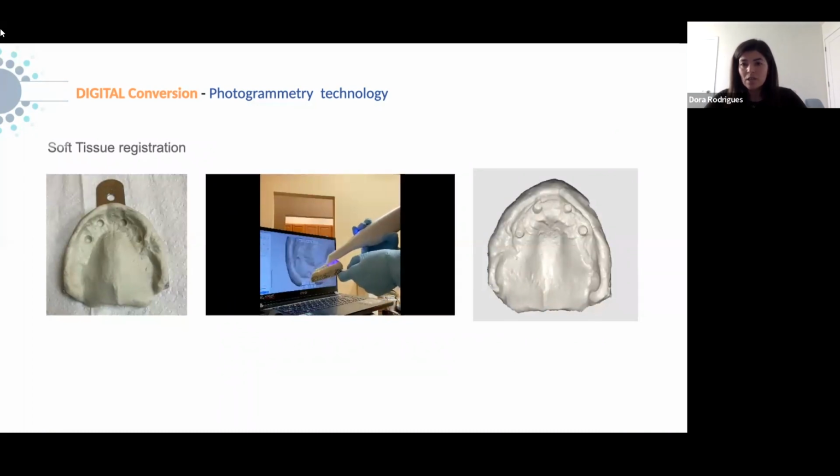It's a lot easier to just take a quick impression and scan it instead of trying to scan the mouth with the blood and everything. It makes things difficult. And I have the intraoral scanner. Most of my doctors do not have an intraoral scanner, so I cannot scan the patient. I do not trust them in terms of speed to try to scan the patient with those conditions, with the blood and sutures and all. So it's a lot easier, although this tray is not for a specific case, for them to take a quick impression at the end of surgery and then me scanning the impression and just bringing it to my software and merging everything.